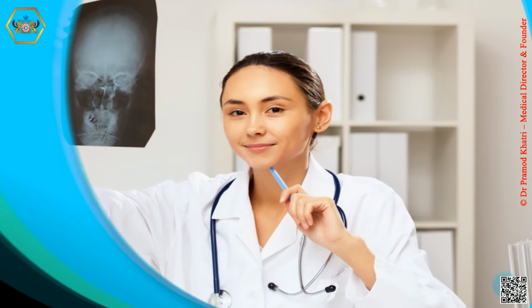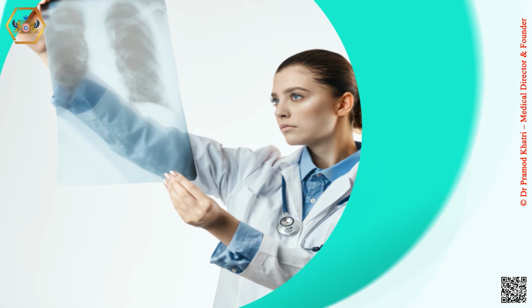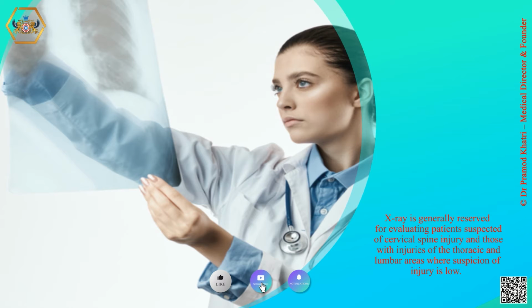The rationale of imaging in spinal trauma is to diagnose the traumatic abnormality and characterize the type of injury, to estimate the severity, potential spinal instability or damaged stability, and to evaluate the state of the spinal cord and surrounding structures. X-ray is generally reserved for evaluating patients suspected of cervical spine injury and those with injuries of the thoracic and lumbar areas where suspicion of injury is low.